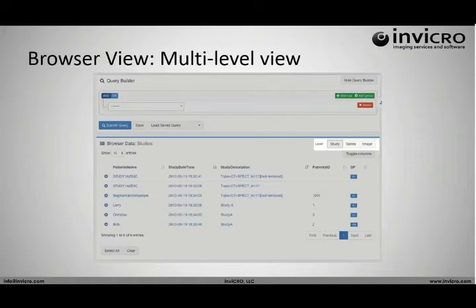The different levels let you quickly get a glance and browse through. For a series, you care more about modality, so you put it on the series level and you can sort by PET scans or something like that, or filter based on study description there. But we found it was an easier way of browsing.